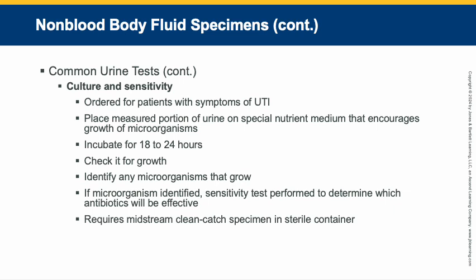But this requires not just a midstream, but a midstream clean catch specimen, and it has to be a sterile collection container. So that urine container has to be sterile. It can't be just for a routine urine that is non-sterile.